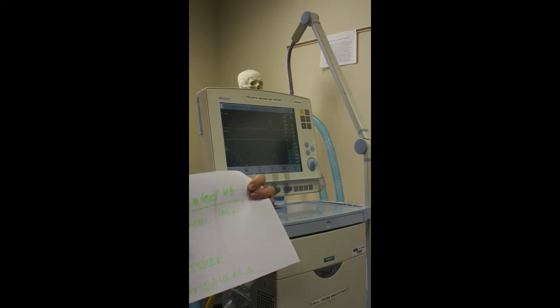The way everyone remembers it is the word complete. COM for compliance, PL for plateau, and EEP for PEEP. Because in a minute I'm going to teach you airway resistance, and it has different pressures, and everyone confuses them. So complete. This is going to be compliance and airway resistance, you guys. You're going to have to know it like the back of your hand.